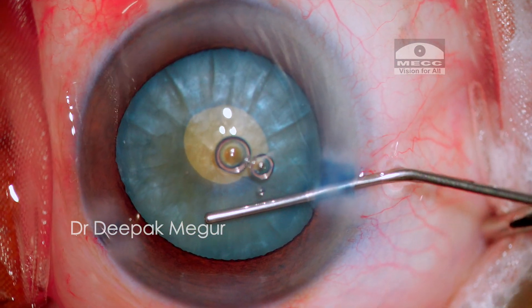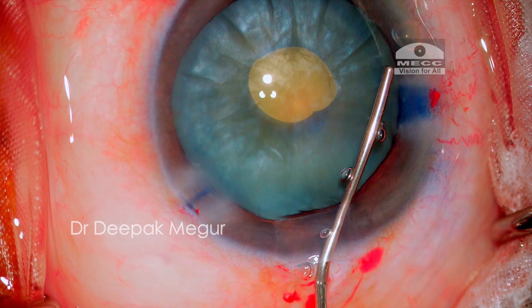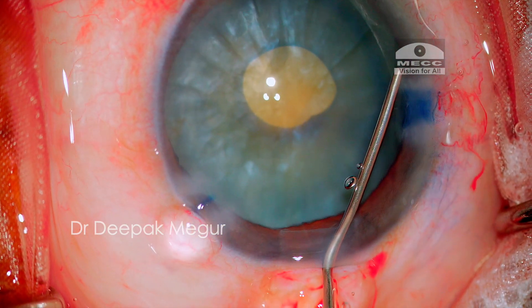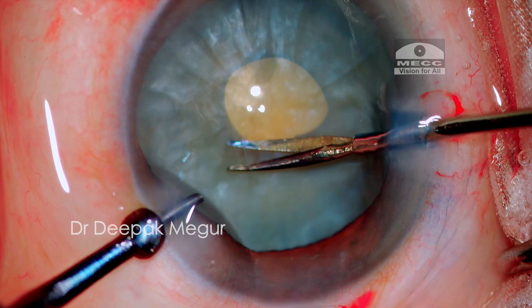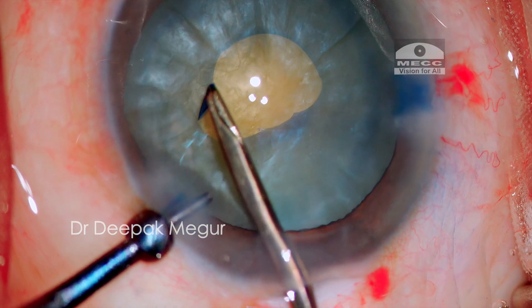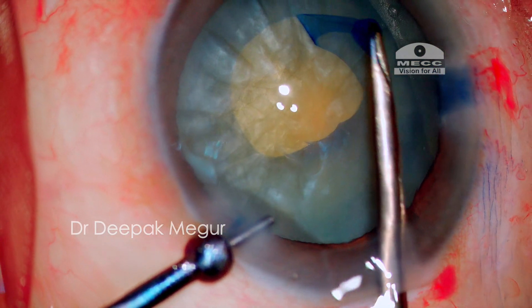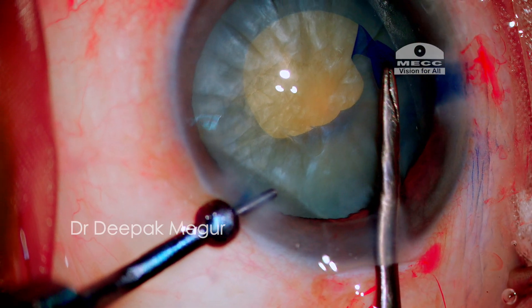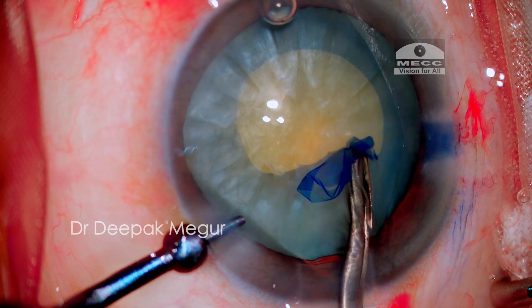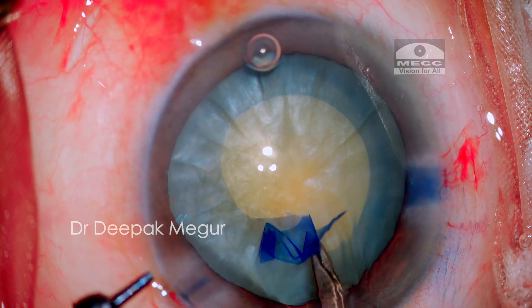Now it is time to enlarge the rhexis. I inject OVD into the periphery of the chamber, minimizing the chance of the bag being inflated by the OVD. Using micro scissors, a tangential cut is made, followed by tearing the flap with the forceps. We now have a central 5mm rhexis. Once the bag is empty, the capsule behaves in a very predictable and controlled manner.